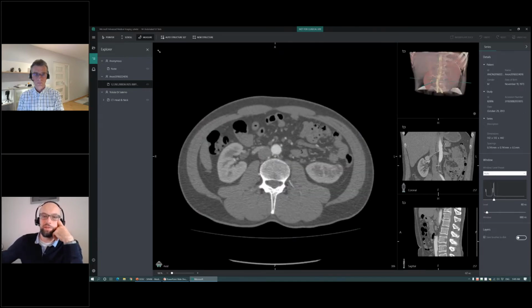a realization that there is a big problem in the medical imaging space with what's called segmentation in traditional computer vision. Segmentation is delineating the boundaries of regions of interest in an image. If you're doing something like, I don't know, an autonomous driving car problem, you would want to take an image and understand where's the traffic sign, where are the other cars, where are the people, and you would want to have exact boundaries for those.